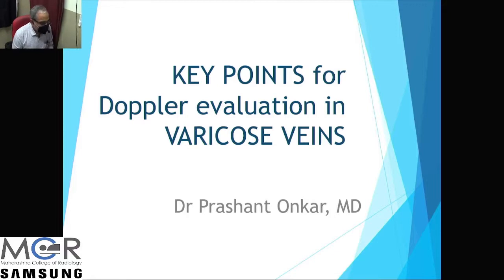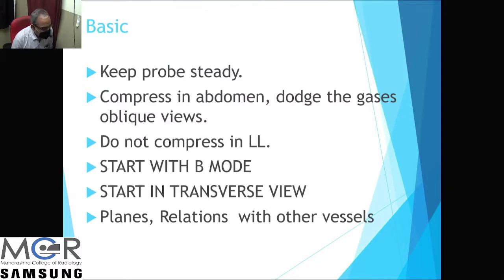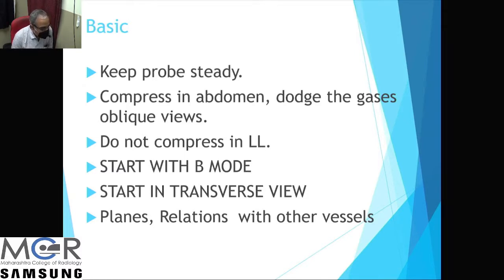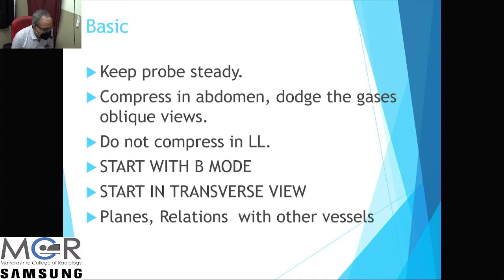We will rush through the key points in Doppler evaluation of varicose veins. First and foremost, keep your probe steady. We are in the habit of moving the probe for abdomen, obstetrics, and pelvis scans, but here the area of interest is very small — hardly five to ten millimetres — so we need to keep the probe steady and follow the course of the vessel. Compression is used to reveal normalcy of the vein.